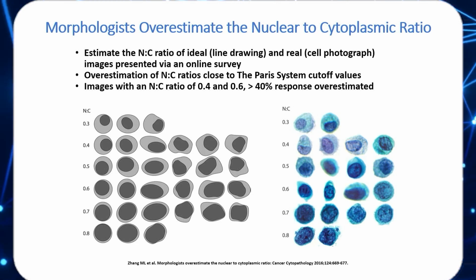You can actually download it from the book, or it's available even online based on the publication here, and you can set it up next to your scope and compare these images for your individual cases. So this would be a good benchmark, what 0.3 is and what 0.8 is, but this is what we are calling 0.7, and more on this.